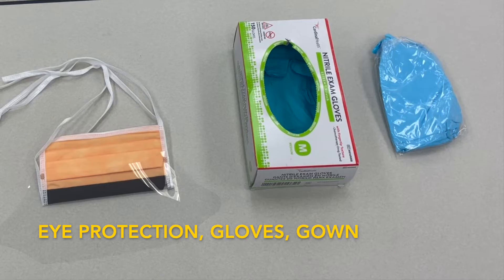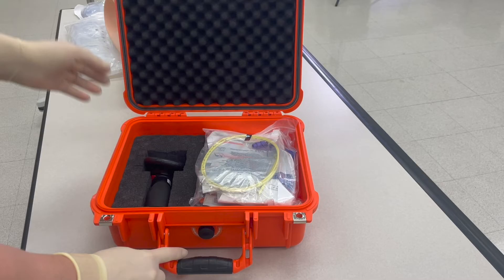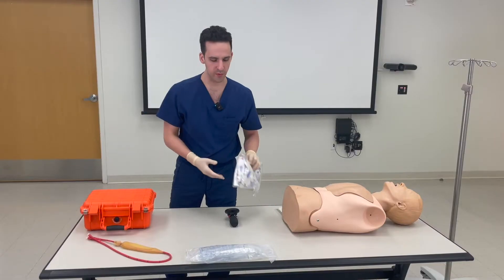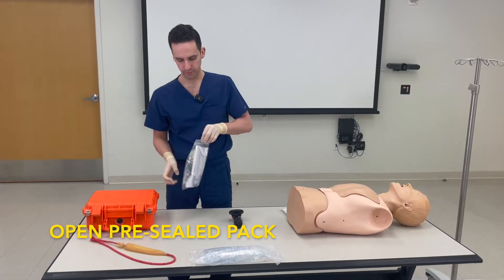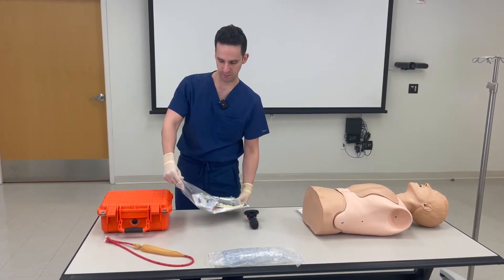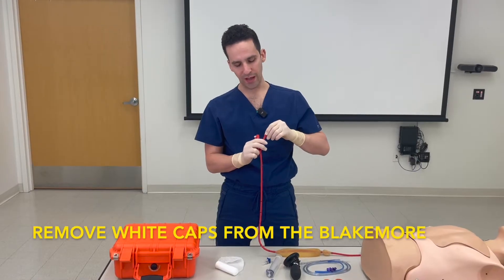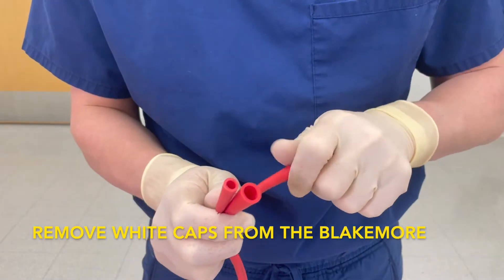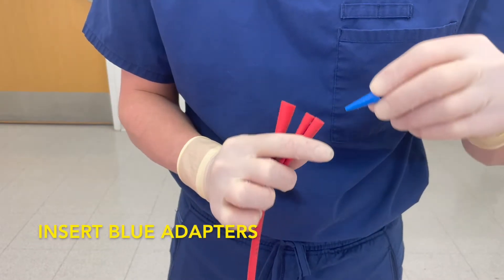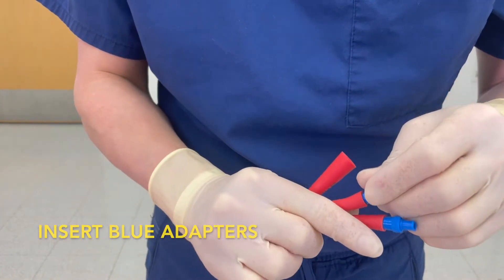Ensure that all of your proper PPE is in place. Open the orange Blakemore box and remove one of the pre-sealed packs, as well as the cufflator. Open the pre-sealed pack, remove its contents, and unwrap all of the contents within. Remove the white caps that come pre-inserted into the Blakemore and place these to the side. Take your blue Christmas tree adapters and insert them into both the esophageal and gastric port.